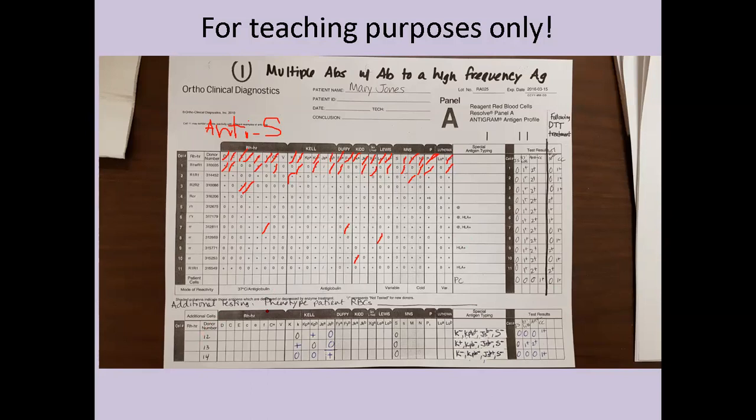We went to another panel and we found in this cell no little k, only KPB is on this one. And remember, we have to make sure that S antigen isn't on any of them because we want to eliminate the reaction from their anti-S. We look at the second cell we picked. This one only has the little k, and no S antigen. And then the last one we picked only has the JSB.